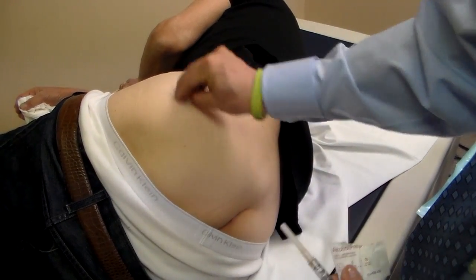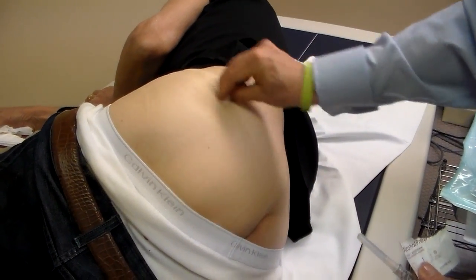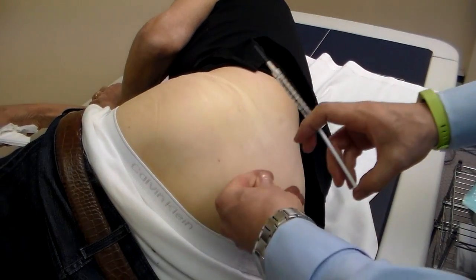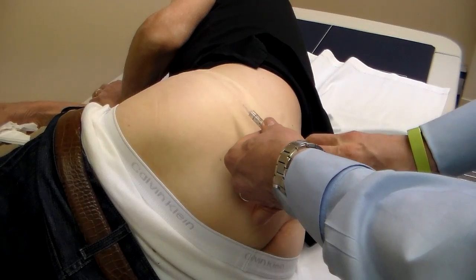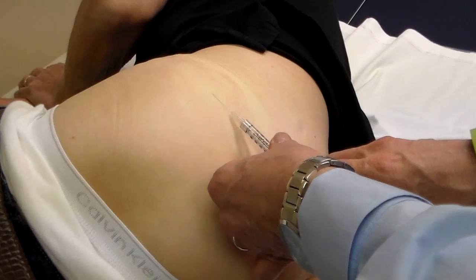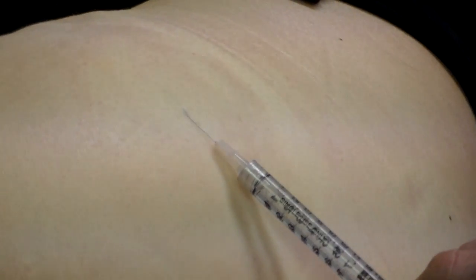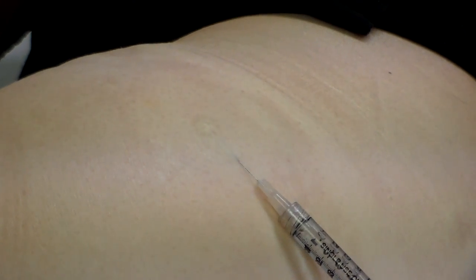First, we sanitize the area in preparation for the numbing medication. We use 1% lidocaine with or without epinephrine — with this gentleman we're using it with epinephrine. In the area where we're going to implant, in a caudal direction, we put a small amount of lidocaine — just one mill, one cc. Too often clinicians use too much lidocaine, which is usually not required. We want to make sure we get a good skin weal raising on the skin.